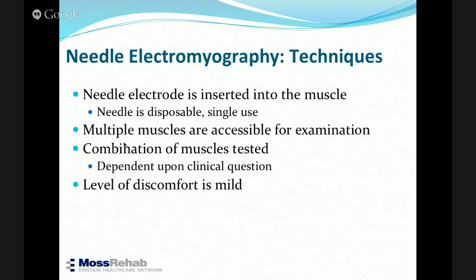What do you mean you're going to shock me and stick me? Be careful. You don't use the word needle, you use the word pin. Pin is softer than needle. It's exactly the same thing, but it's softer. Right? You put a pin in and you listen to the muscle. So when you explain it that way, you are not going to create terror in the patient's mind. Then you will be able to get farther ahead, get things done. It is an uncomfortable test. It's not an unbearable test. But you have to explain that appropriately.